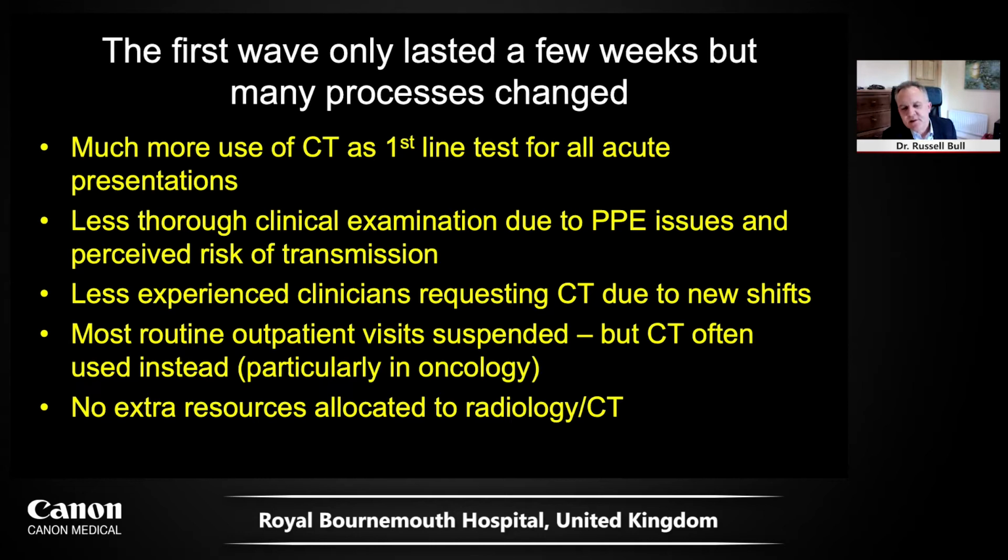Most routine outpatient visits were suspended, but CT was often used instead of those outpatient visits. It was used as a sort of virtual outpatient visit, particularly in oncology. We weren't expecting that. So they were using the follow-up CT as the outpatient visit. And sadly, no extra resources were allocated to radiology or CT to cope with this.